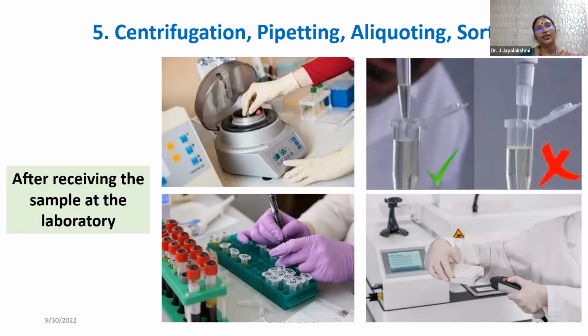The other is that whatever time the sample is received is taken as the collection time also. The collection time and receiving time are the same. Many systems, when they click into the barcoding, the reader would capture that particular time at that point of sample collection. So when the sample is received at the laboratory, they will have to redo it.